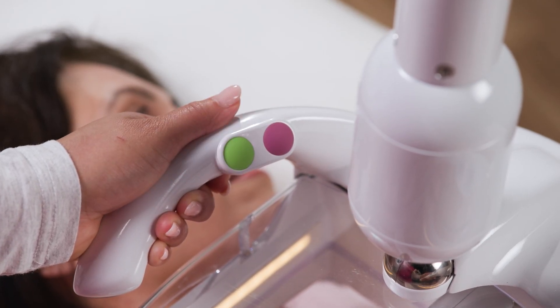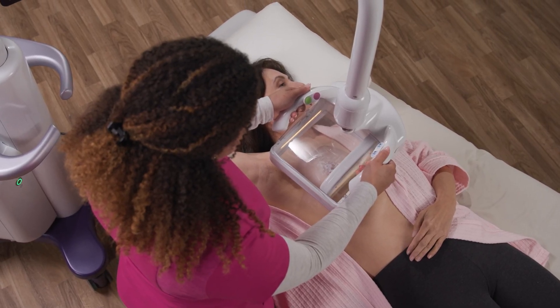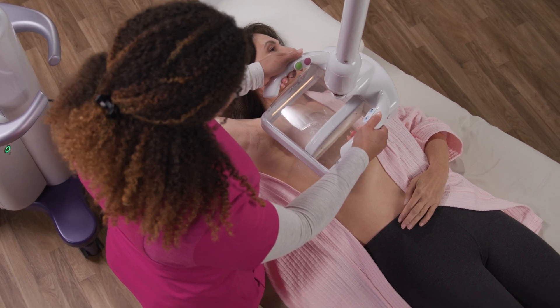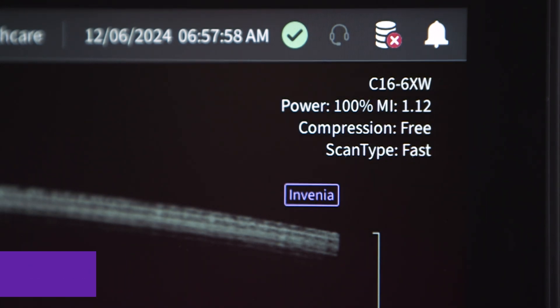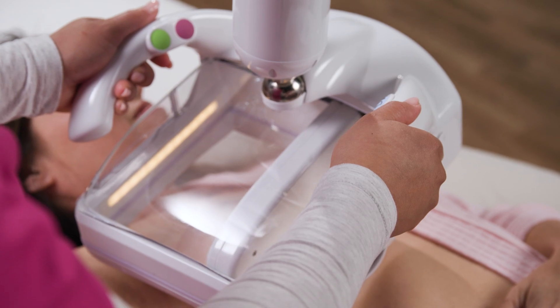With the touch of a button, the operator begins the acquisition. The transducer moves from the inferior to superior edge. Each acquisition takes under 35 seconds, while the novel fast scan feature increases scan speed by 40% to ensure high patient throughput.